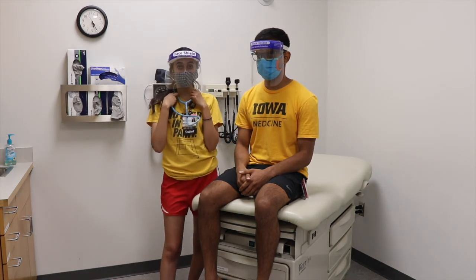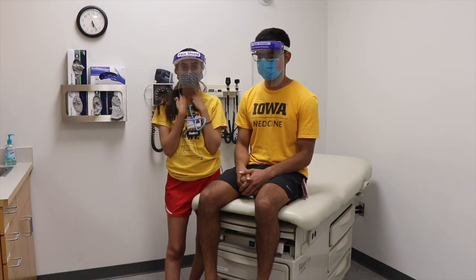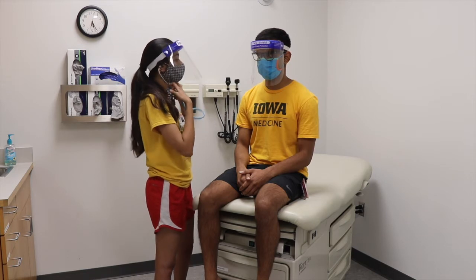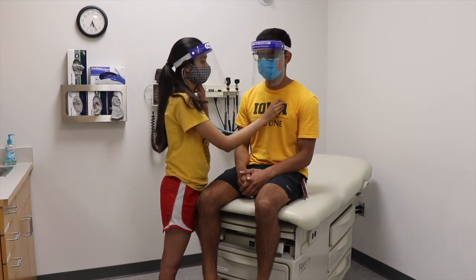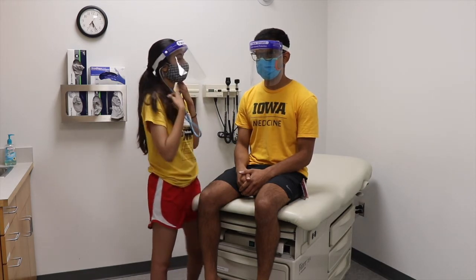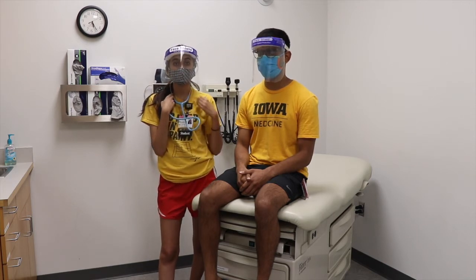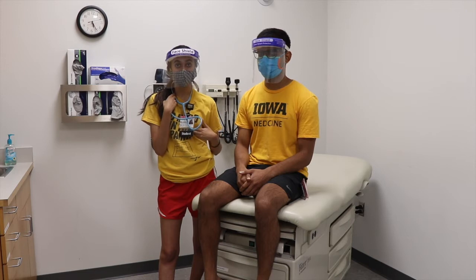Next, we're going to listen to the pulmonic valve. The pulmonic valve is on the left side, again at the second intercostal space. So for that one, I would listen right there. And the next one we'll listen to is the tricuspid valve. The tricuspid valve is also on the left side, but in the 4th intercostal space.